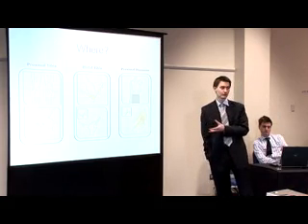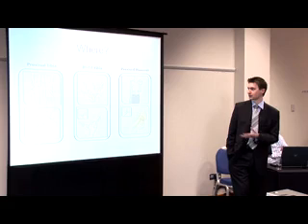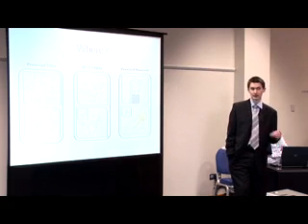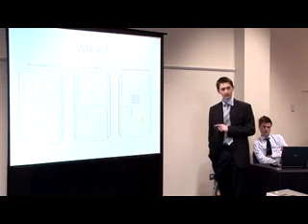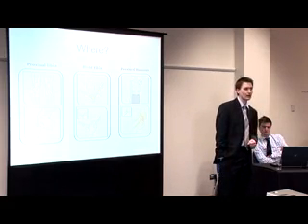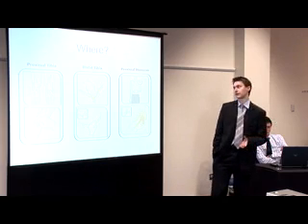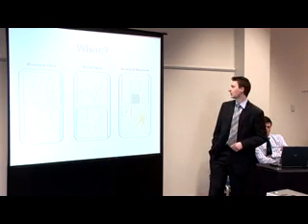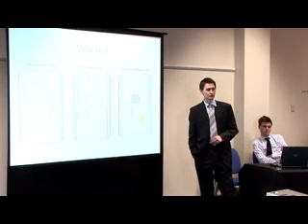You can go in the ankle as well. So you feel the medial malleolus, and you go 4 centimeters above, so they always say 2 finger breadths, and it's again the flat part of bone. The proximal humerus is going to be used more often. It gets into the central circulation very, very quickly. Okay? It's within a few seconds. And it's often one that people are a bit more reluctant to use.